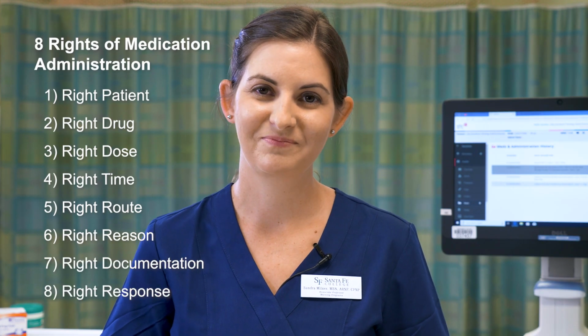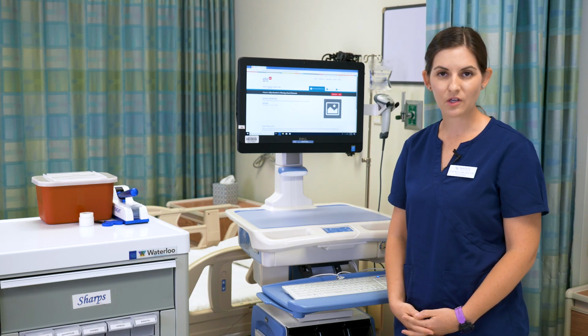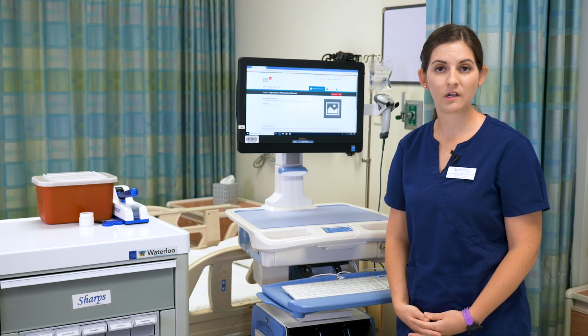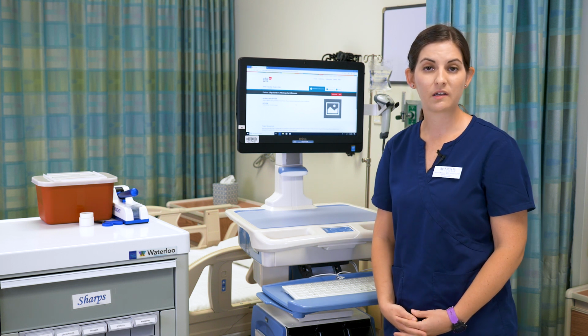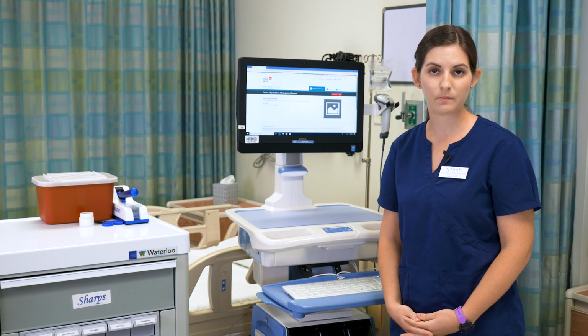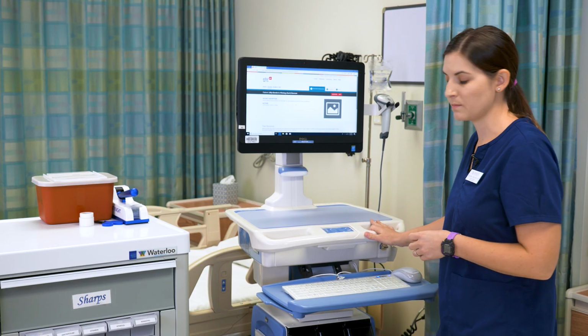right response. We're going to check Ms. Duncan's chart for the correct dose. We're going to double check it against the drug guide. We're also going to make sure that we know how quickly we're going to administer the medication, and we're also going to check for compatibility. She did not have any other running IV medications, so we don't really need to, in this case, worry about compatibility. So I'm going to double check her chart and then pull my medication.